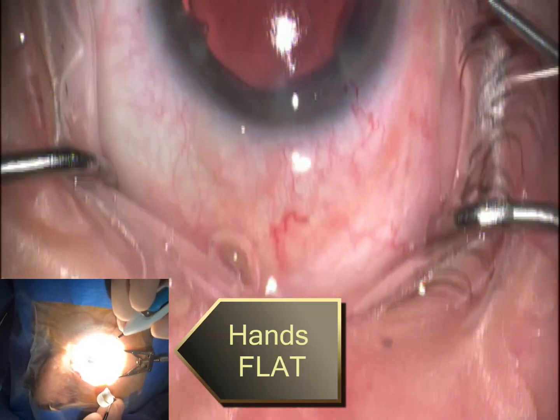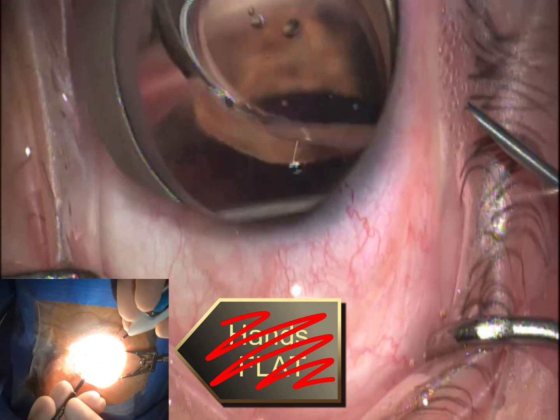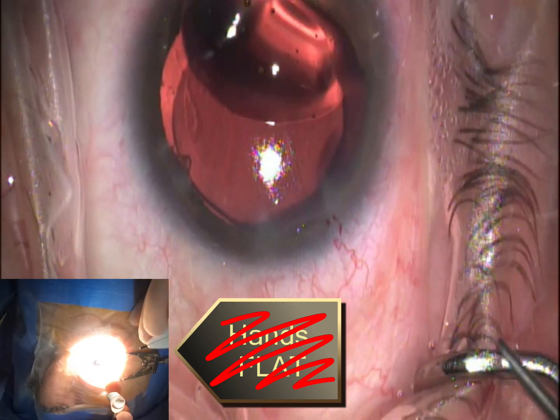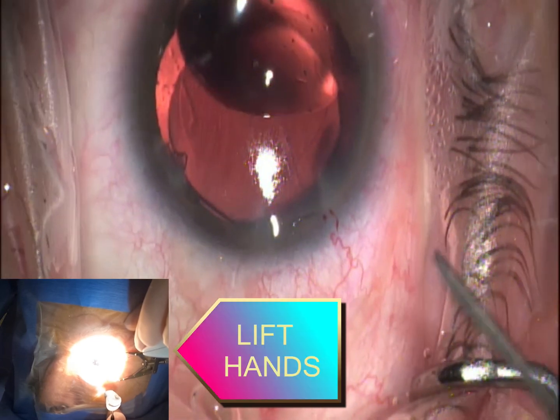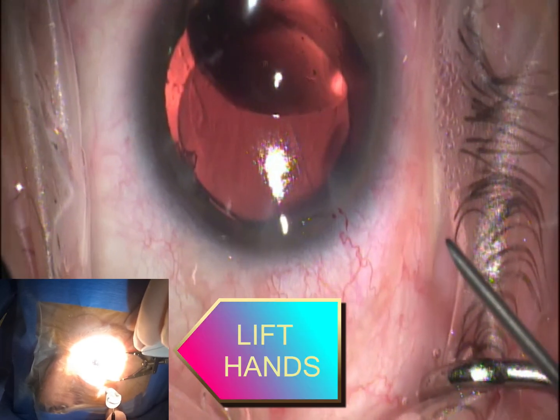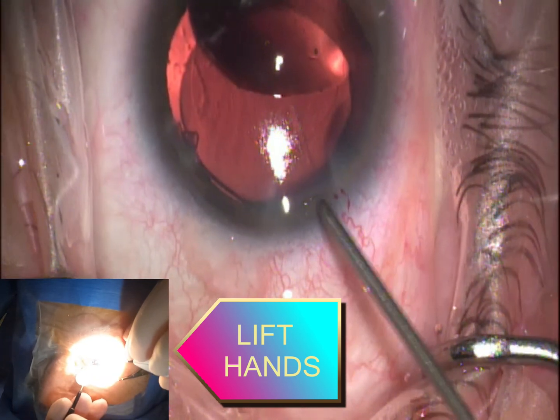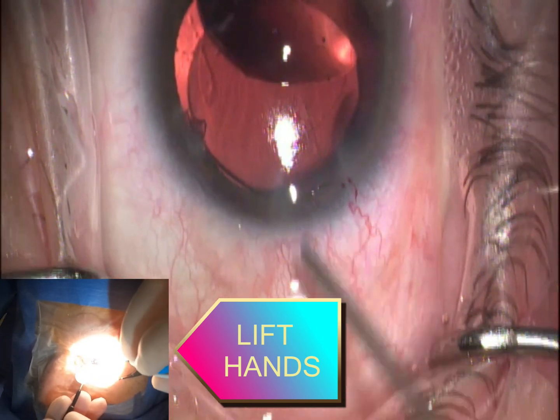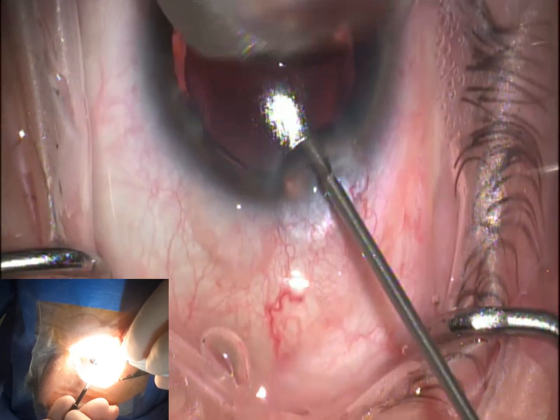When you're in this position, make sure you're not reverting back to your old FACO techniques. I try to hold my hands up compared to where I would for FACO — for FACO I hold my hands straight, kind of parallel with the patient's face. Here my face is tilted, so to stay parallel I have to lift my hands up. You can see the bevel of the needle is coming down as I wiggle my way into the primary incision.